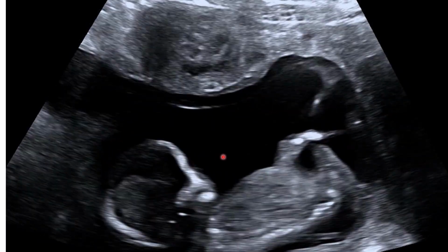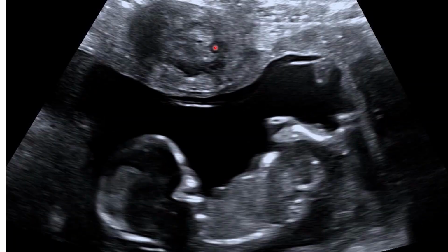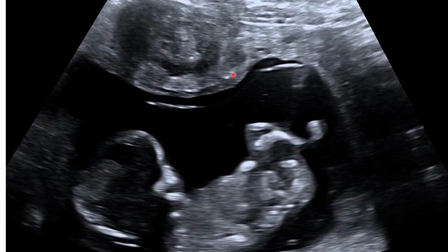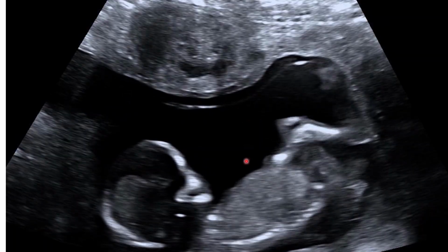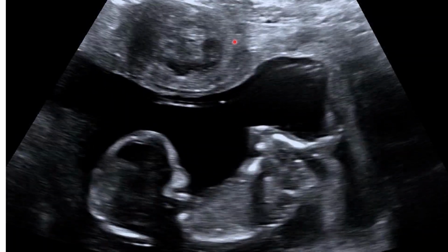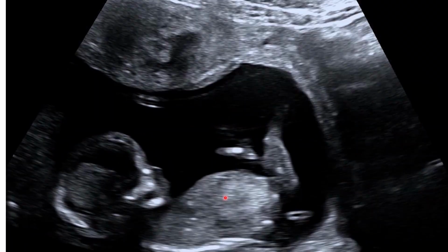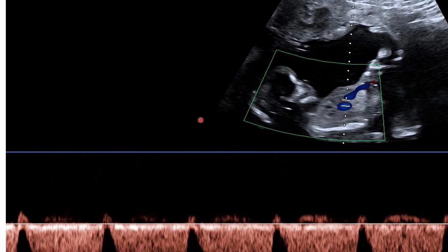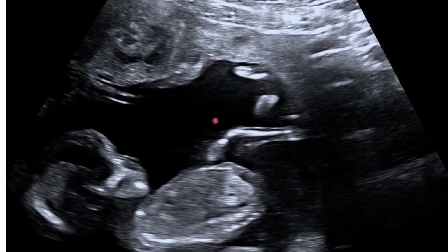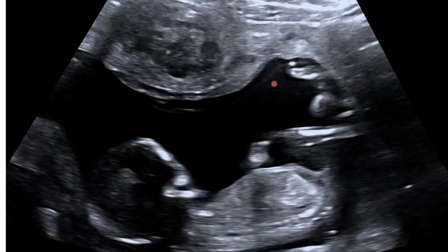So most women just get pregnant without assessment of these fibroids, and they can become a problem when they get pregnant. Like now, this patient came complaining of lower abdominal pain. So the mass effect of the baby when it's growing will be compressing the fibroid, and when it's compressed, it creates the problems. It creates the pain and all that.